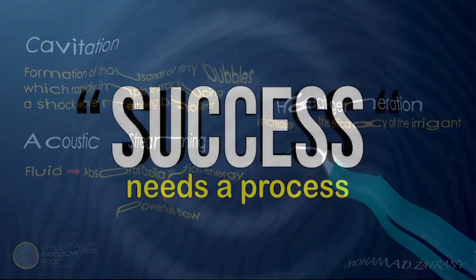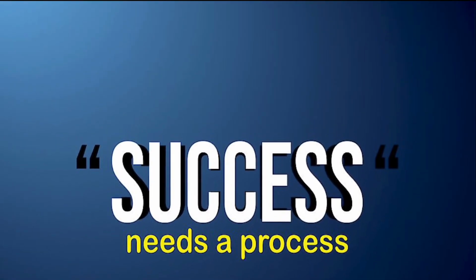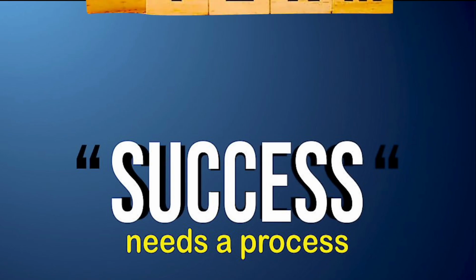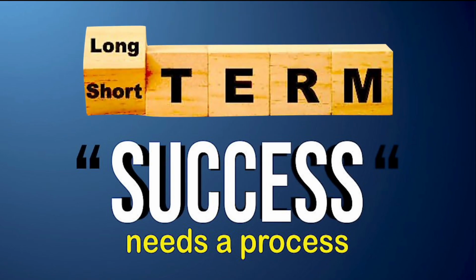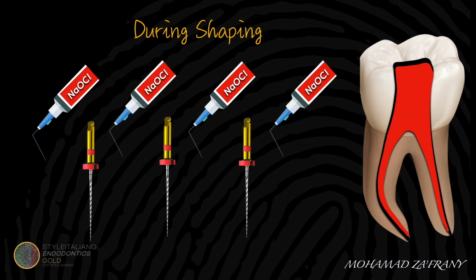In endodontics, we seek success. Not only success, but a long-term success. That's why we need to develop a feasible, teachable, repeatable protocol for irrigation. During shaping, sodium hypochlorite is used during instrumentation and between each file, and the time of this step couldn't be calculated correctly, so we can't consider this time in the irrigation protocol.